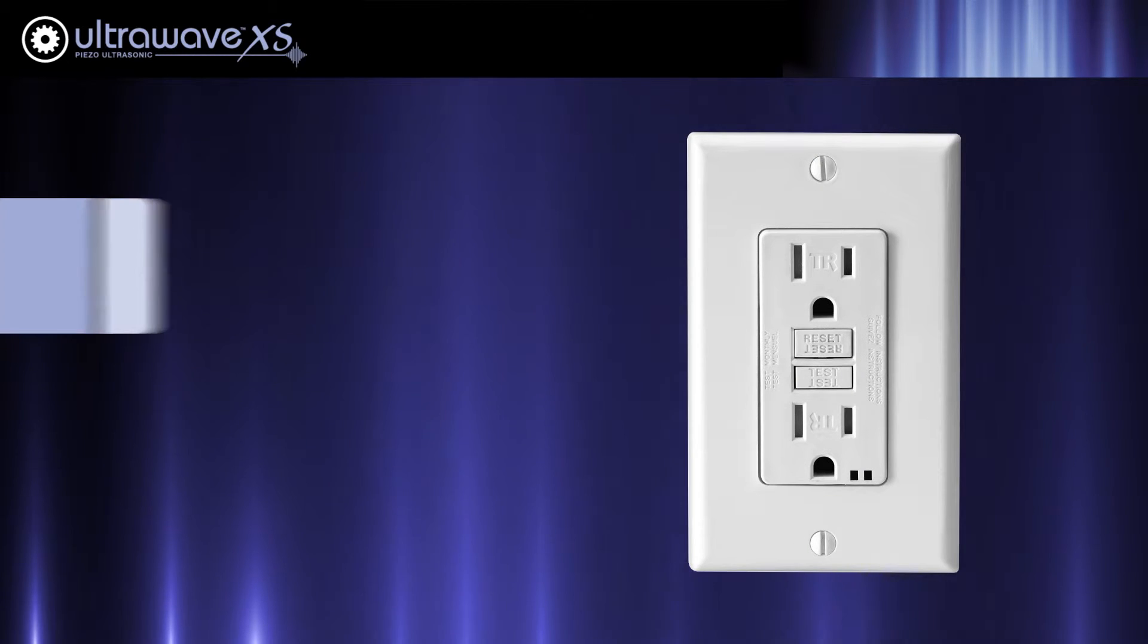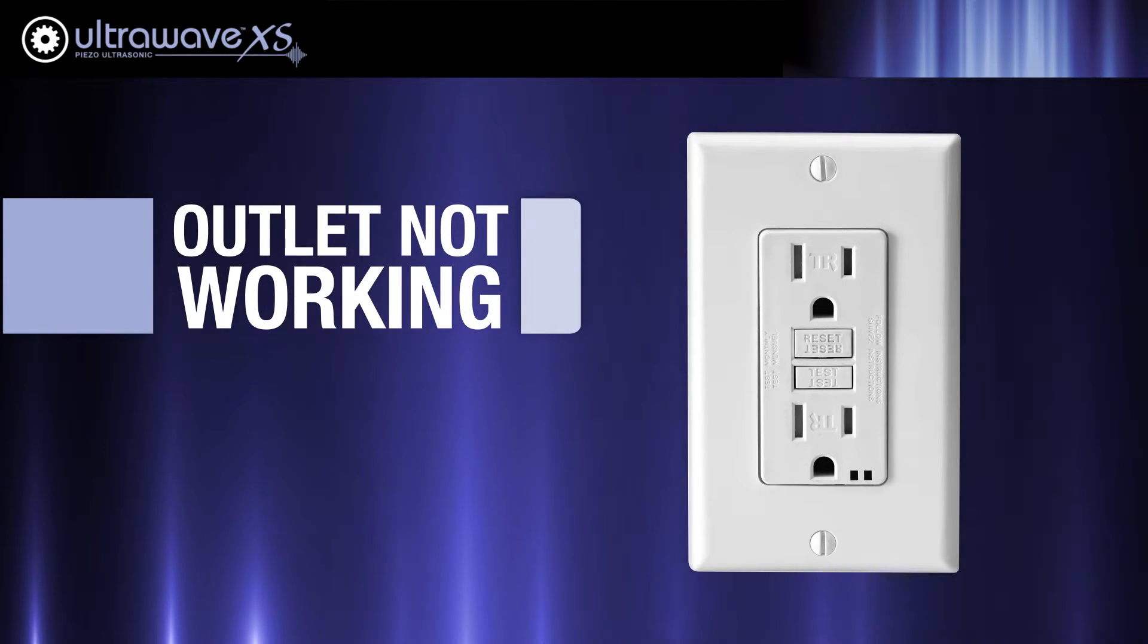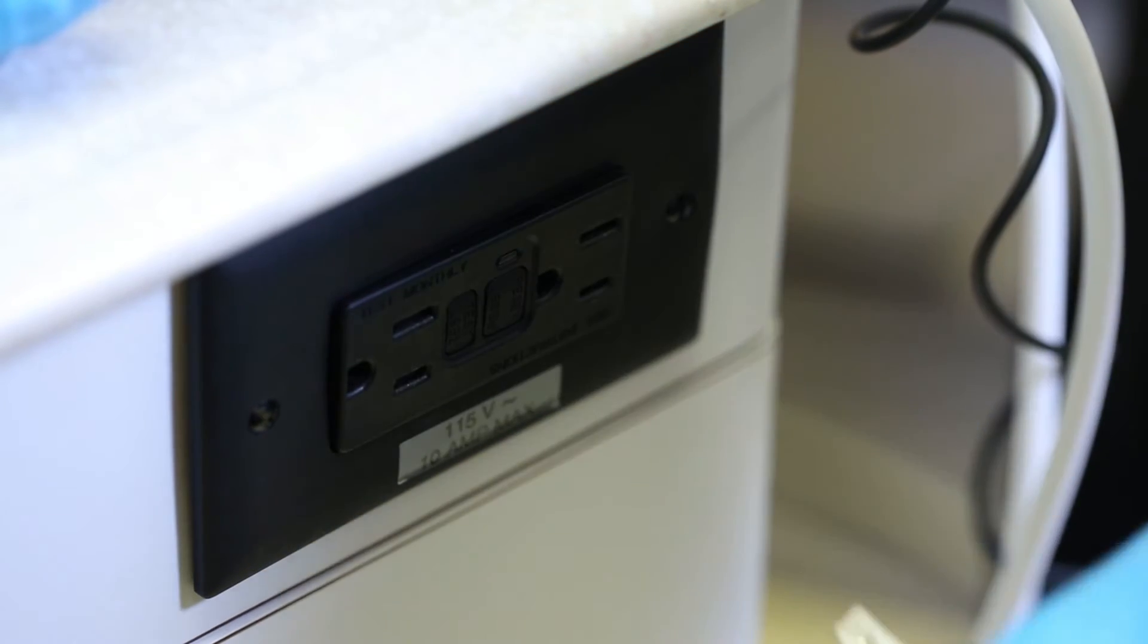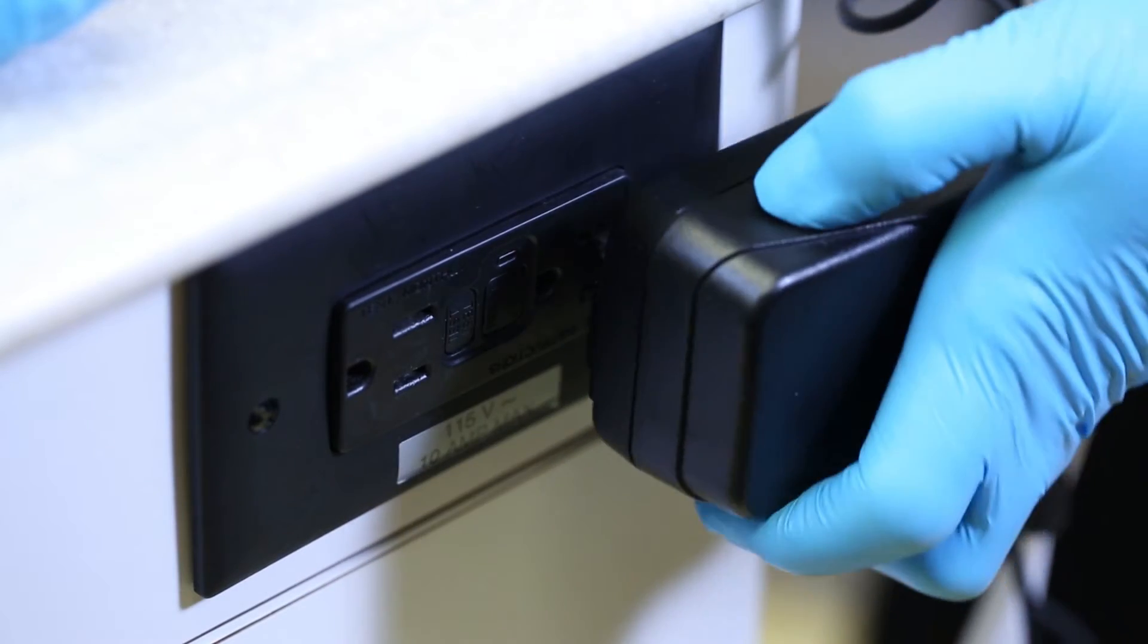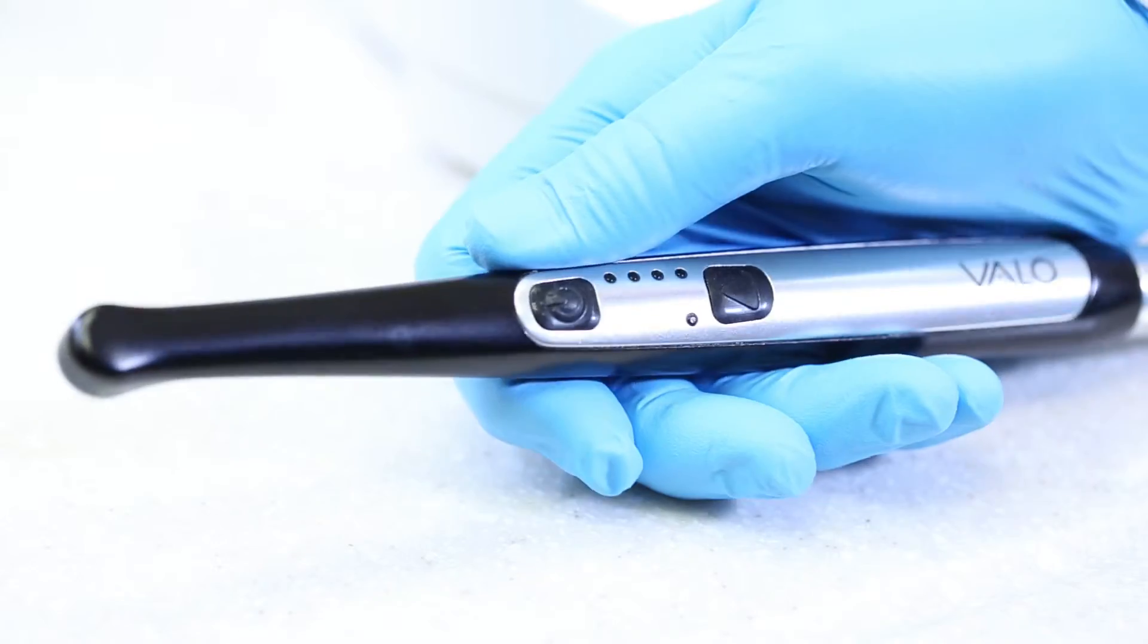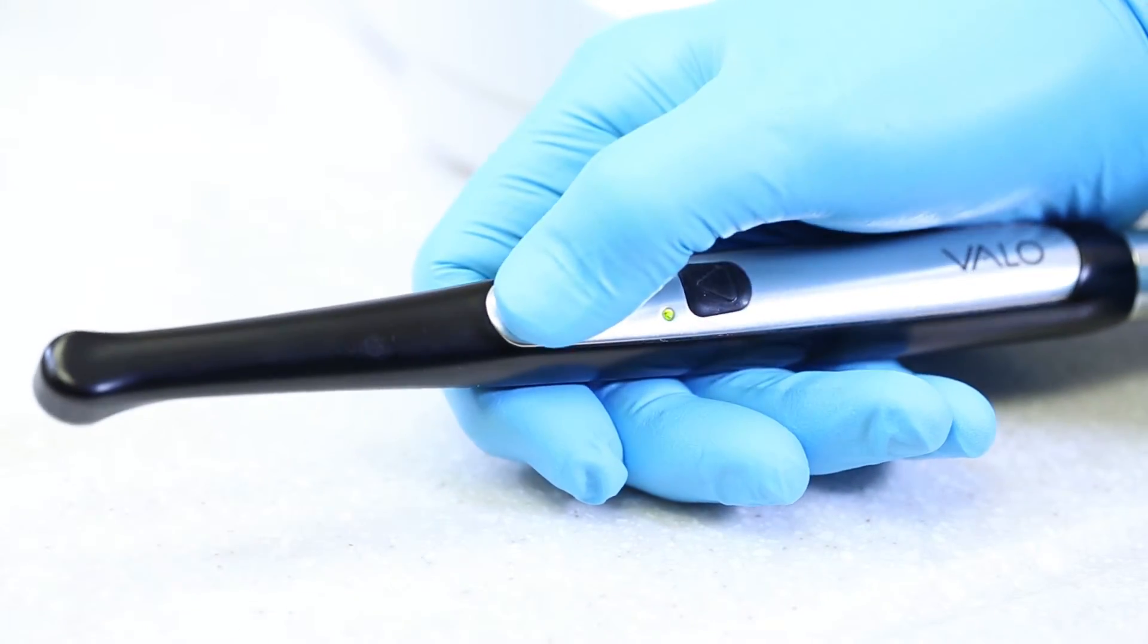If your ultrawave XS is not working, make sure there is not a problem with the outlet itself. You can do this by simply plugging in a different electrical device into the same outlet to see if it works. You can also move the ultrawave XS to another room and test it in an outlet there.